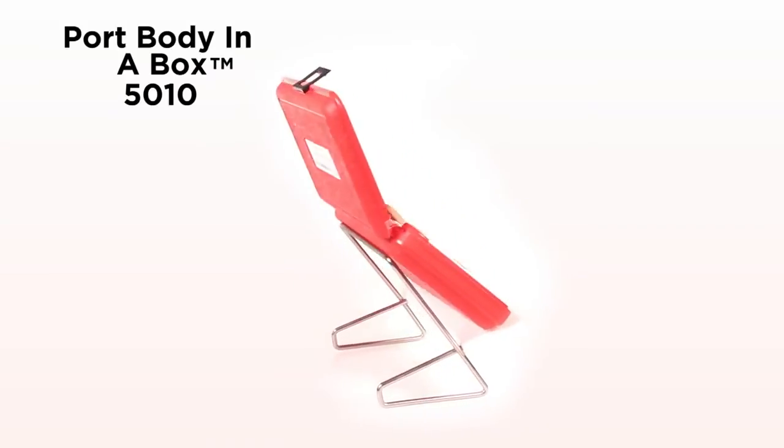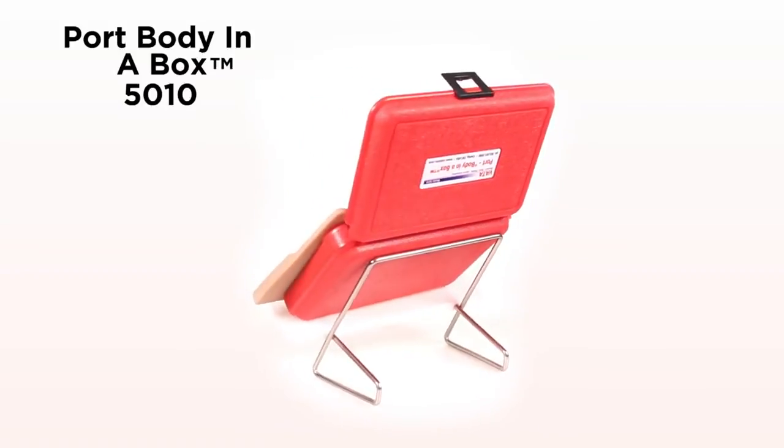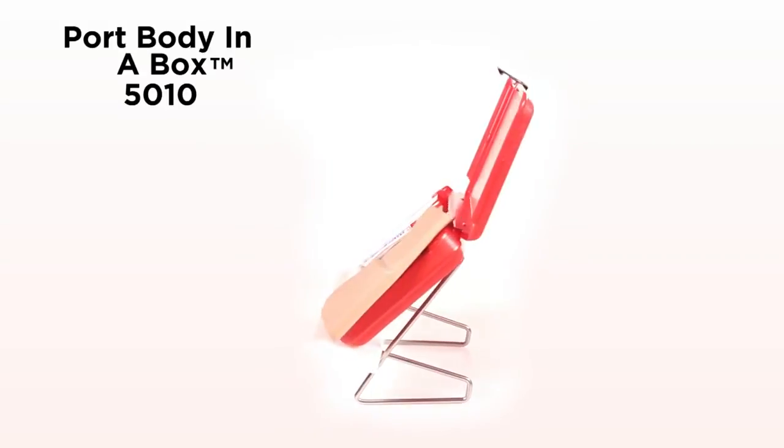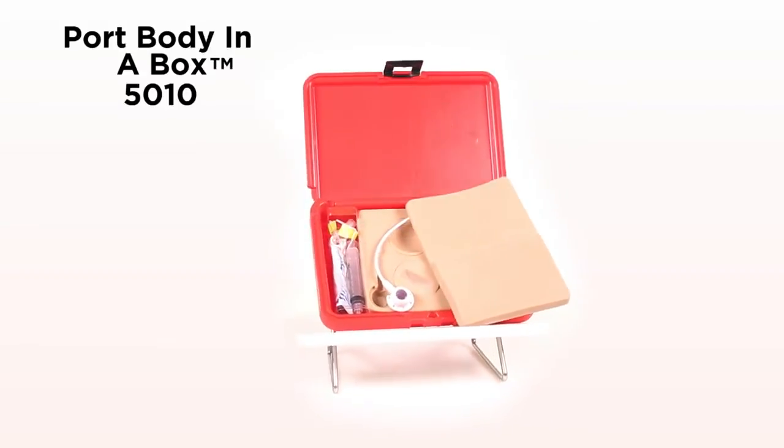Port Body in a Box Model 5010 is for the practice of palpating and accessing implanted ports. This is a cost-effective, lightweight, easily transportable model that is ready to use when opened.